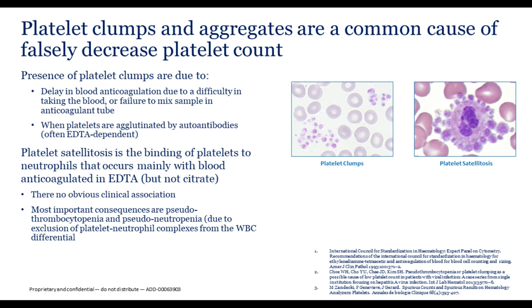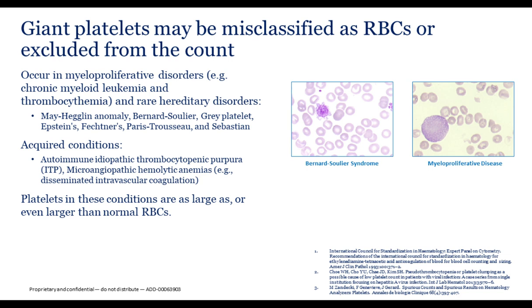Platelet clumps and aggregates are a common cause of falsely decreased platelet counts, as visible on smear review. Platelet satellitosis — platelets surrounding white cells — would also decrease the platelet count. Giant platelets may be misclassified as RBCs or excluded from the count entirely. They occur primarily in myeloproliferative disorders such as chronic myeloid leukemia, as well as acquired conditions like autoimmune idiopathic thrombocytopenic purpura and microangiopathic hemolytic anemias. Platelets in these conditions can be as large as or larger than normal red cells, causing overlap between the platelet and red cell populations in most automated systems.